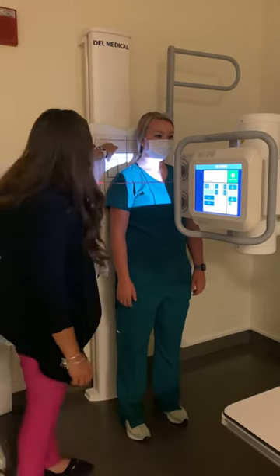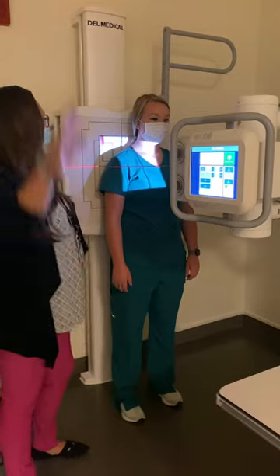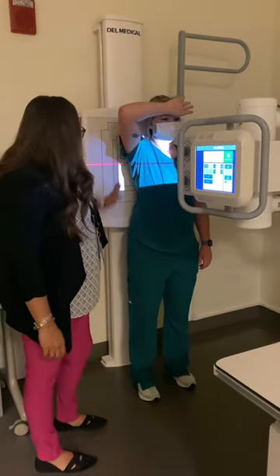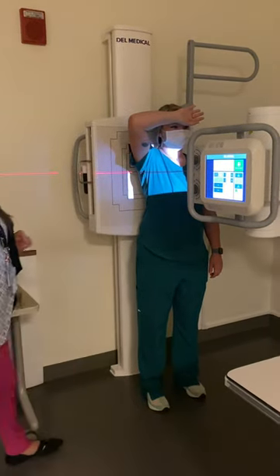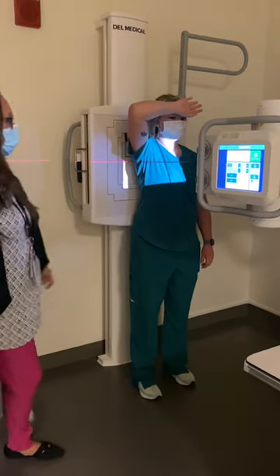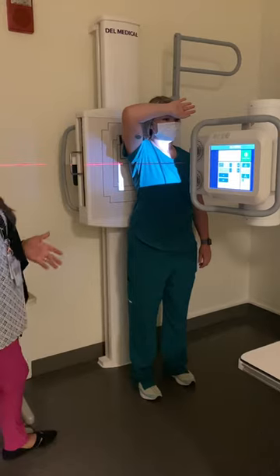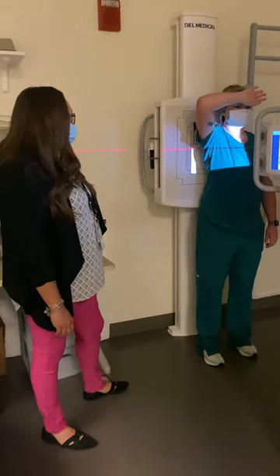Usually, my medial side of my light is going to be at the mid-sagittal plane. I'm going to put a right marker in the upper corner there. Then what I'm going to have my patient do is extend their arm up and put the back of your hand up against your forehead. I should have a little sliver of light here. For this one, I'm going to do a breathing technique - have my patient take short, shallow breaths, and I'm going to extend my exposure time to blur out the lung markings so I can see the scapula.